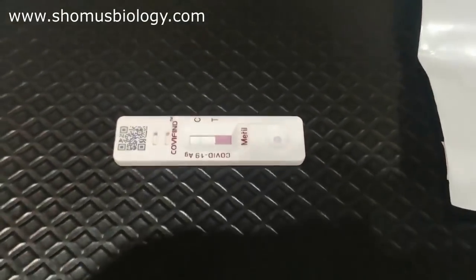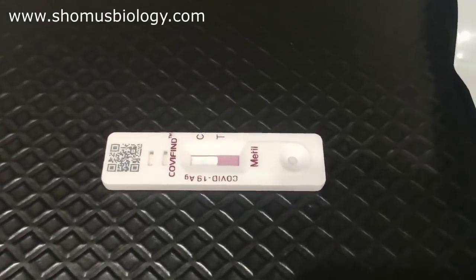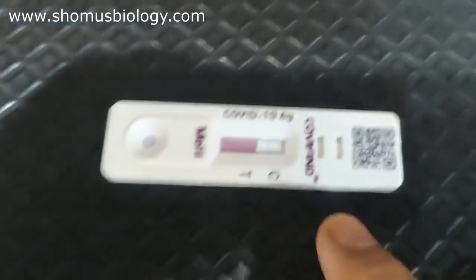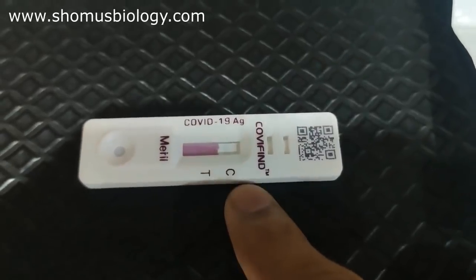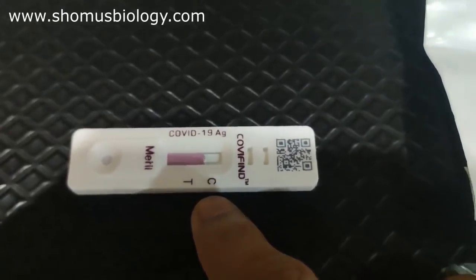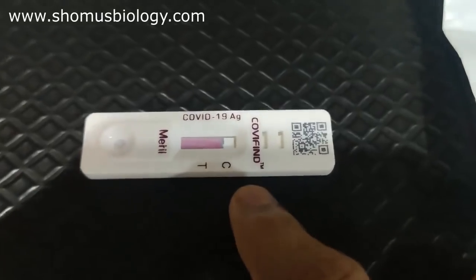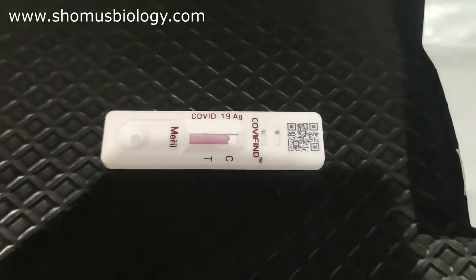Now simply wait for 15 minutes. Turn on the countdown timer in the app and wait for the result. Remember, the cassette has two markers: C for Control and T for Test. If there's only one band at C, you're negative for COVID-19 antigen. If there are two bands — one at C and one at T — you're positive. If there's no band at C, the test kit is damaged.